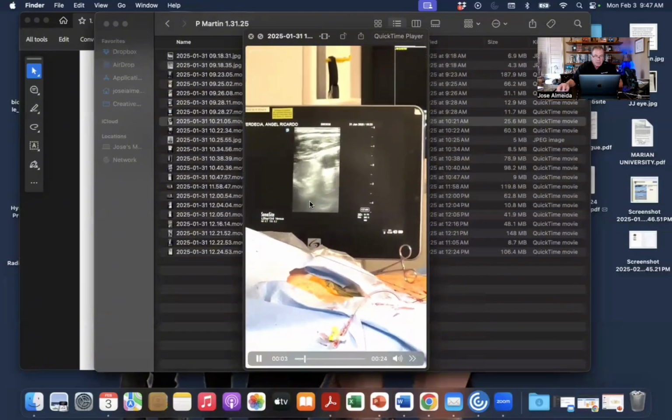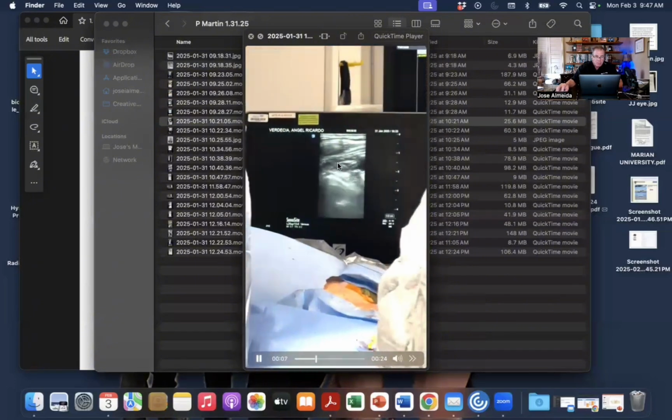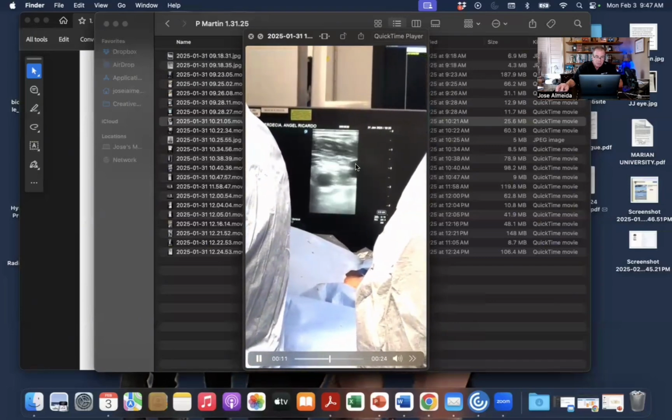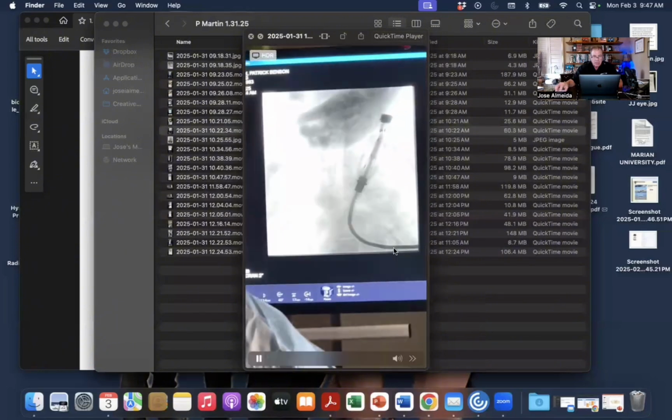Now, what are we doing here? Going to get access from above. This was strange, that the carotid artery was over here and the vein was lateral. The internal jugular vein was very lateral. So that was unusual. So we had to be careful.